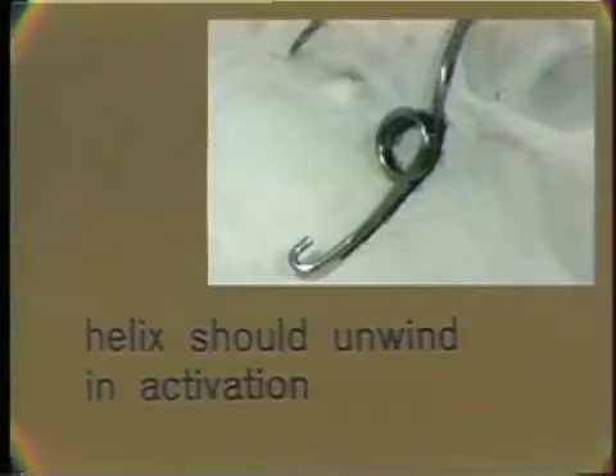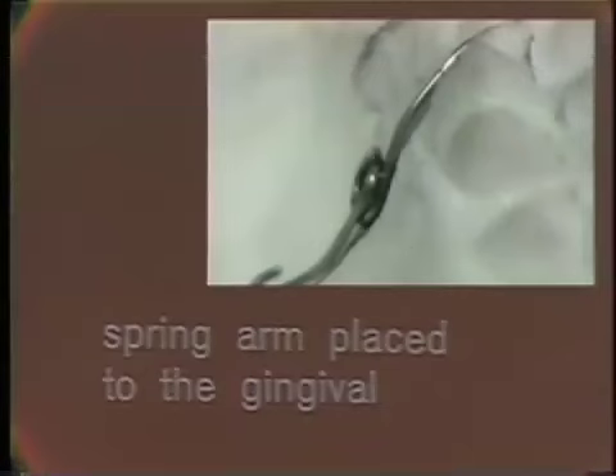The finger spring has now been formed. The criteria for a good finger spring are: first, proper spring design — the wire size, the spring arm length, and the helix position must be correct to produce the amount and direction of tooth movement desired. Second, the helix should unwind in activation; the natural tendency of the wire to unwind will help the spring action. Lastly, the spring arm is placed to the gingival. In the mouth, the natural tendency of an activated spring is to slide up the side of a tooth toward the occlusal, so positioning the spring arm to the gingival will help maintain an effective spring contact with the tooth.